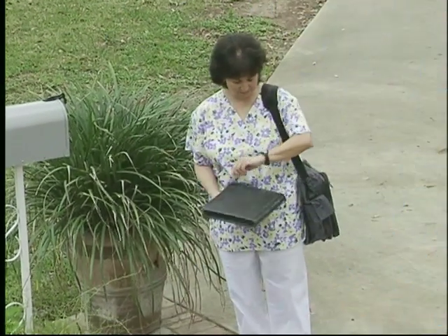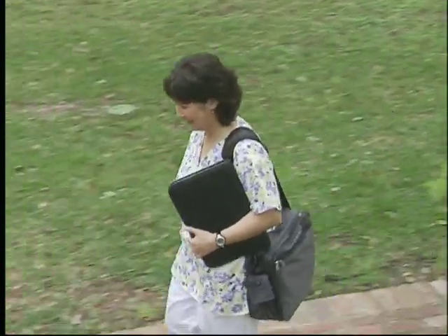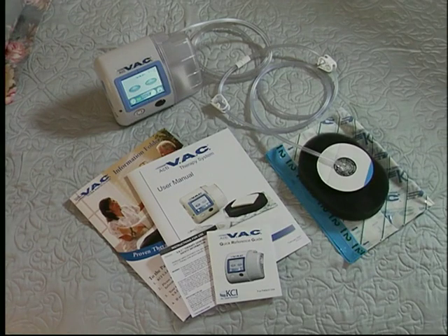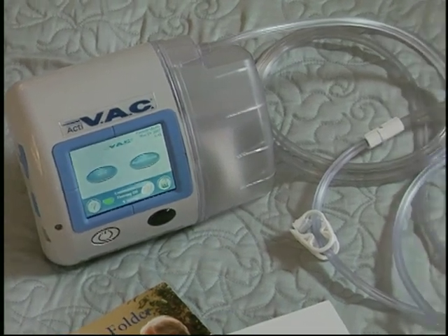Hello, today I'm going to tell you about the ACTIVAC Therapy System, an advanced wound healing system that could have a vital role in your recovery. The ACTIVAC Therapy System can enable you or anyone with an appropriate wound to receive VAC Therapy, while maintaining comfort and mobility.